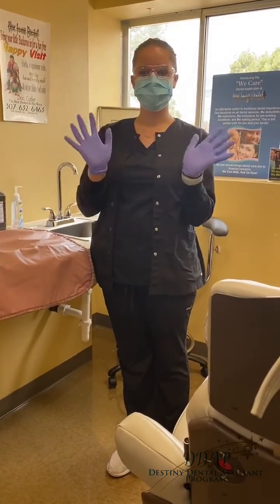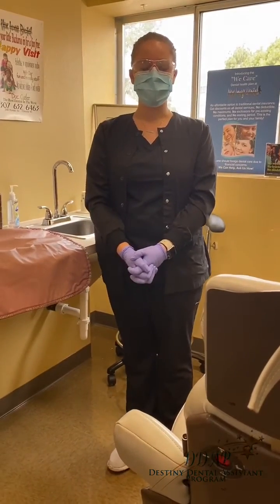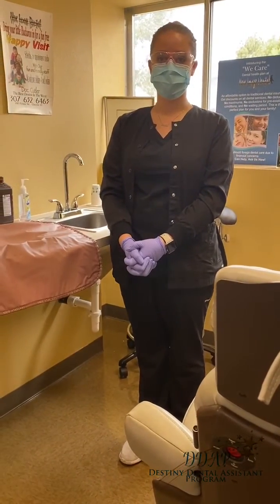Here's Megan. As you can see, she's wearing her PPEs. She's going to demonstrate how to disinfect the x-ray equipment that we just used.